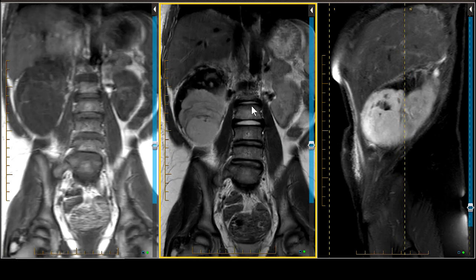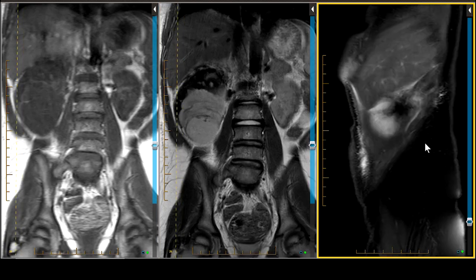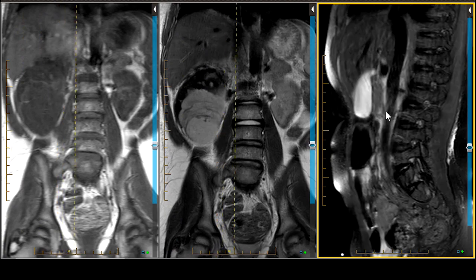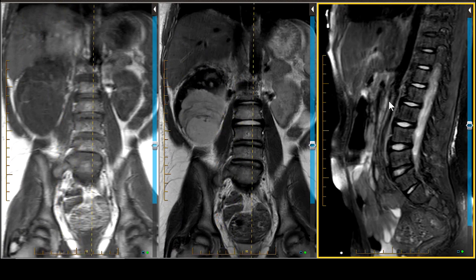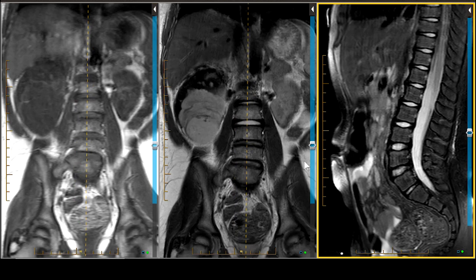Crossing of the midline, which we do not have here, also favors neuroblastoma — though nodes don't necessarily count as direct crossing. On the sagittal projection, the solid tumor is not crossing the midline and the spine looks clean in terms of metastatic disease. Extension behind the aorta, through neural foramina into the spinal canal, and skeletal metastases would all favor neuroblastoma. Age is really critical when forming a differential diagnosis for a renal mass in a young child.